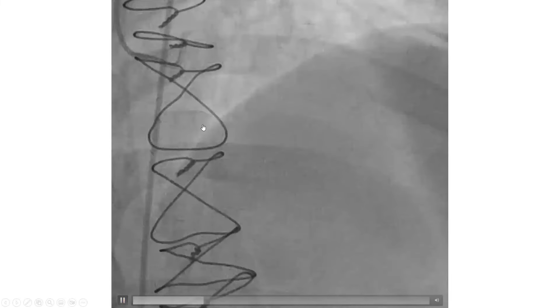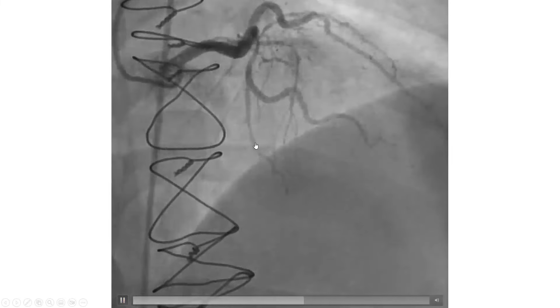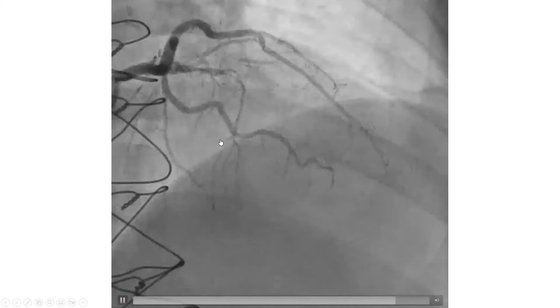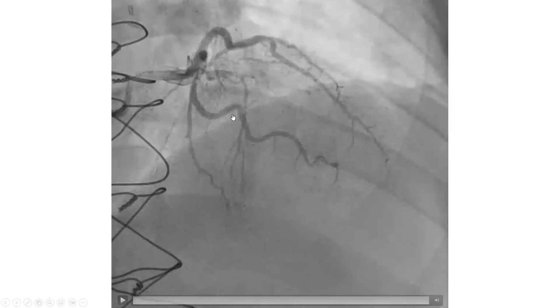This is an LAO cranial view. Again, you can see the lift on that OM as well.